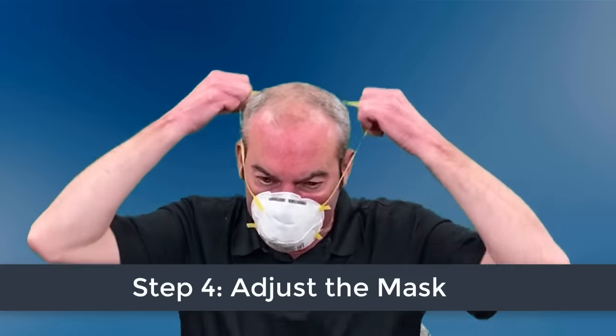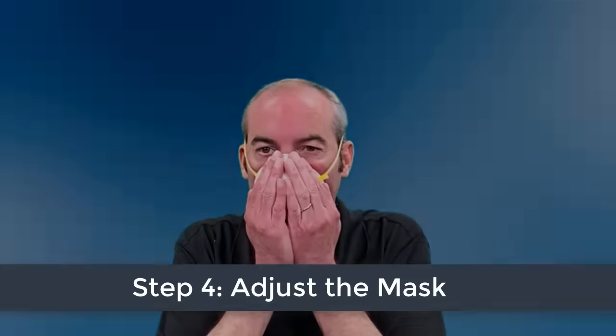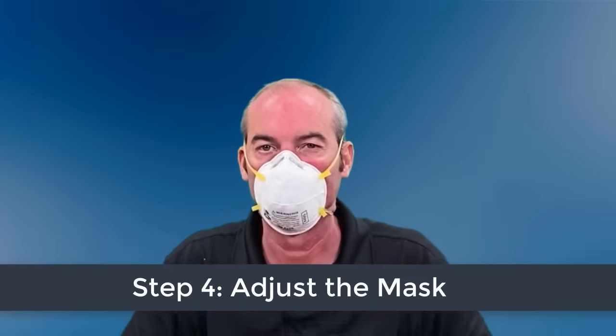If you do not have a proper seal after repeating the steps, ask for help or try a different mask. Once your mask is on with a proper seal, do not touch it.